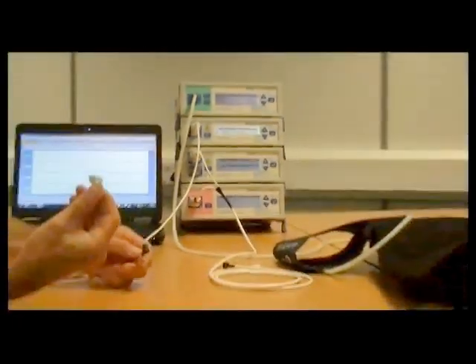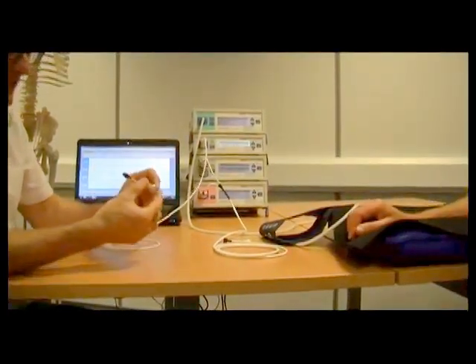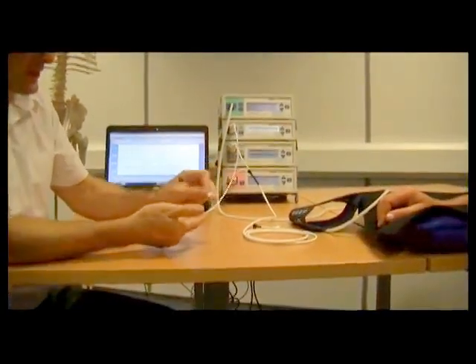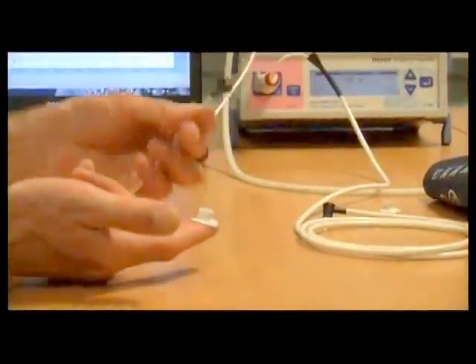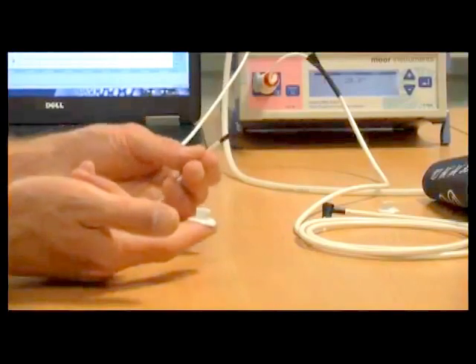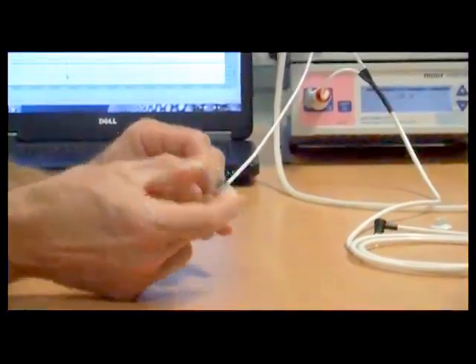To attach the probes, we use these probe holders here. They're white, rubberized probe holders, perfect for adhering to the fingertip, as you can see. The probe head fits into the probe holder like so, just pushes in gently.